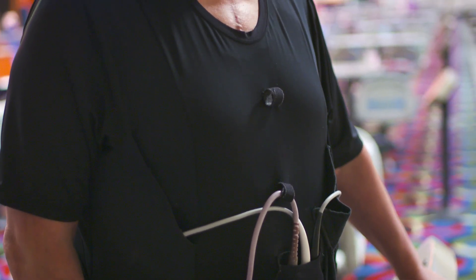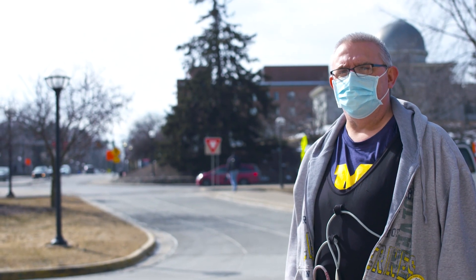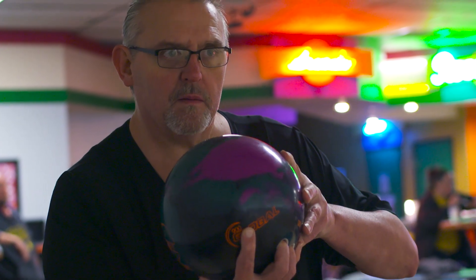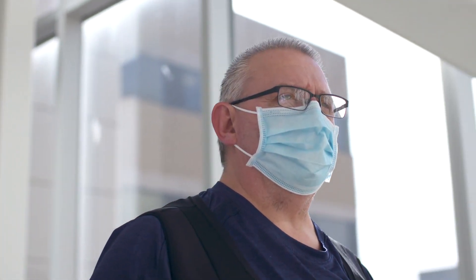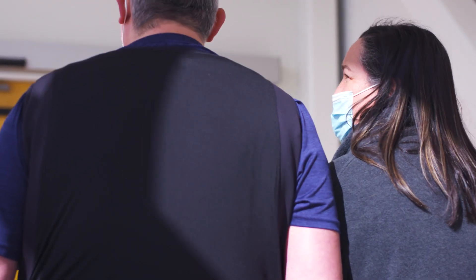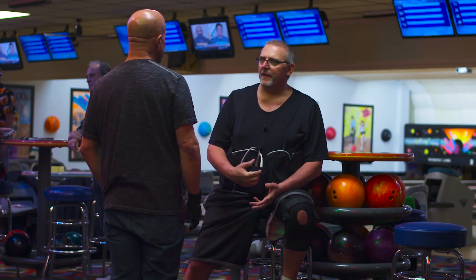Heart failure is a leading cause of morbidity and mortality in the United States. One of the treatments used to manage advanced heart failure is an implantable ventricular assist device known as a VAD. VAD technology has a prominent role in extending and improving the lives of patients with advanced heart failure. In an emergency, being familiar with the skills and protocols necessary to care for patients with VADs is crucial. This video will demonstrate how to assess and care for an unresponsive patient with a VAD without adequate perfusion.